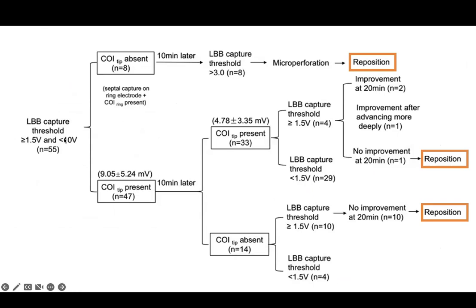They have this idea that you implant your lead, then do unipolar threshold testing. And if your threshold is high, i.e. over 1.5 volts, and you don't have a current of injury, they essentially say that you should reposition the lead because there's likely a microperforation if the threshold continues to increase.